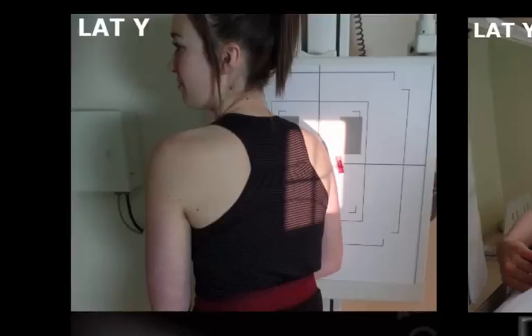We have turned the patient approximately 45 to 60 degrees depending on their body habitus to get them in a good true lateral position. Notice how the humerus drops down along the longitudinal axis of the body. It's not brought back and it's not pulled forward. This will ensure that the scapula maintains that good Y positioning that we're looking for.